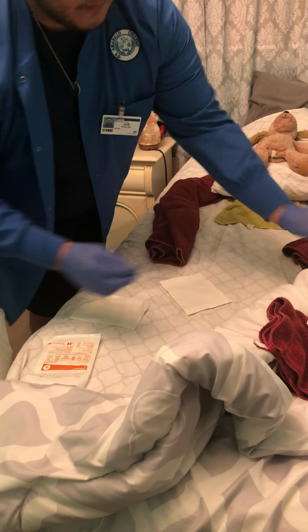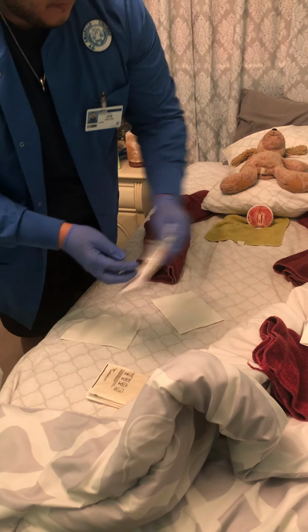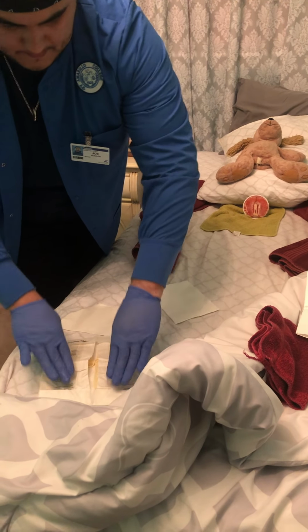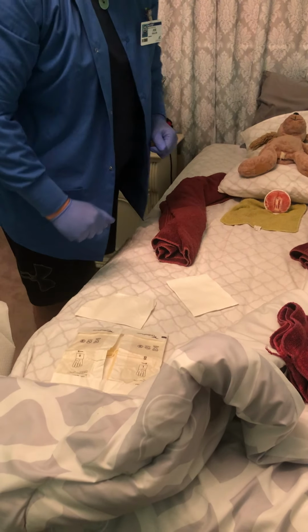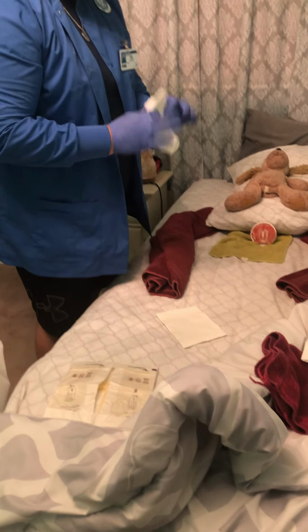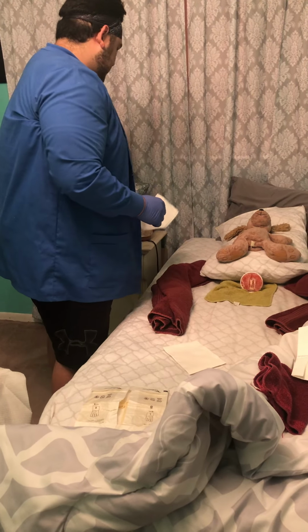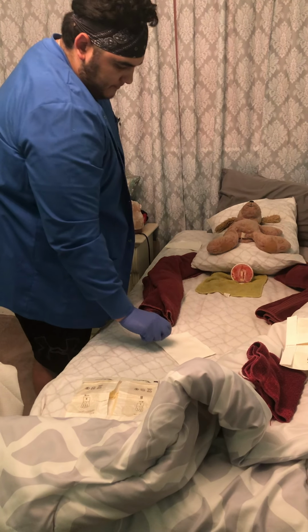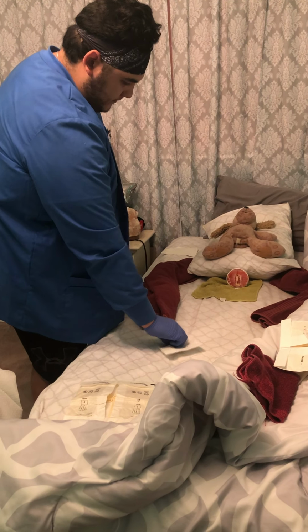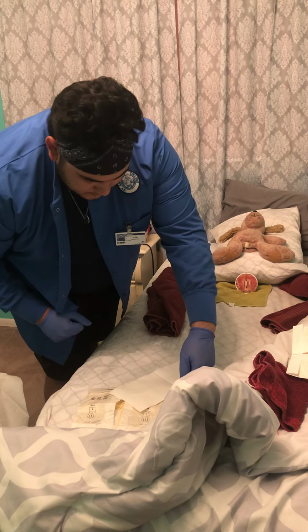So I will not be using this pair, but this drape here is for whenever you're going to cath a male patient. So we're kind of just going to put this over to the side.